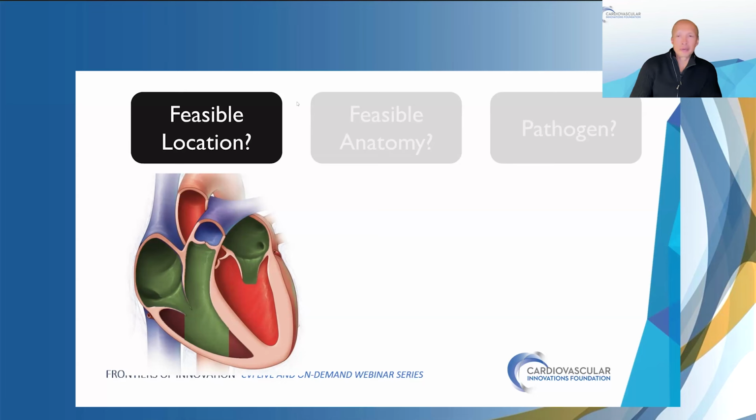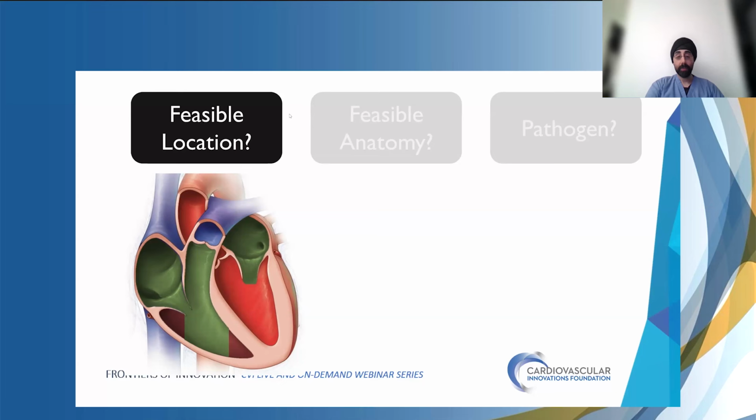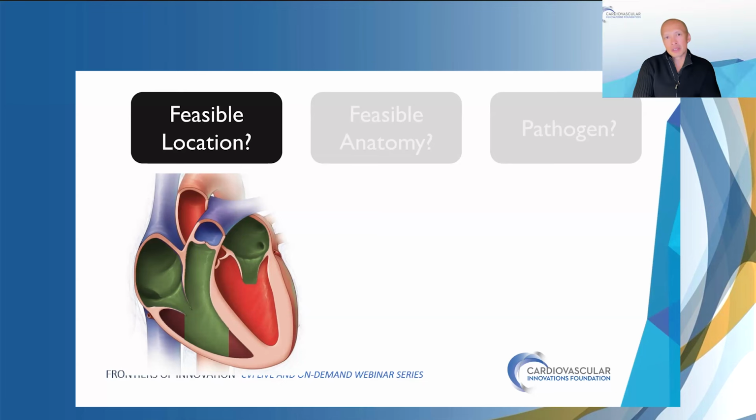Yeah, Sanjay, I completely agree. The devices we use are pretty gentle. Yeah. And I have taken out valve tissue inadvertently. In my opinion, if it comes out with a gentle device, it's not a functioning valve, and it's not meant to stay there. And so it's pretty gentle, and it's pretty rare, I think, to have valve damage.